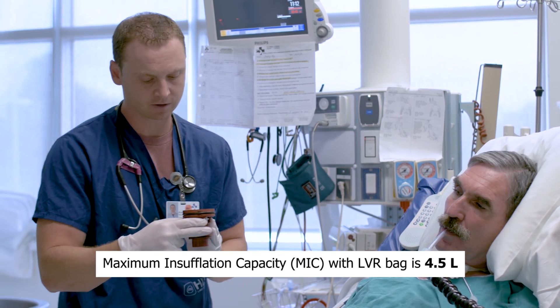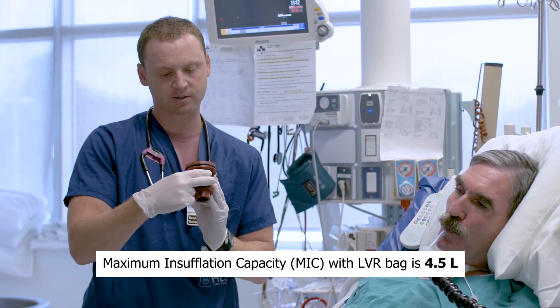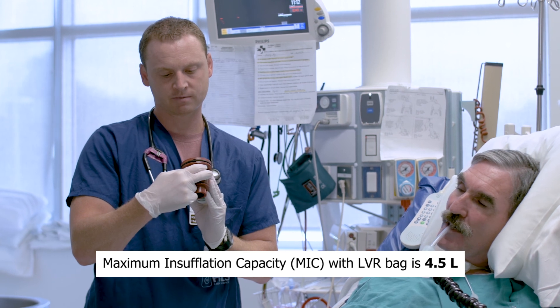Great, Greg. Your volumes were 4.5 liters. All right, that's good. Thank you.